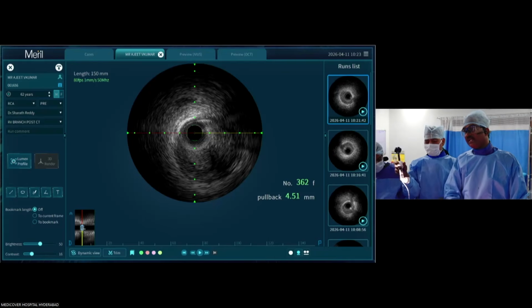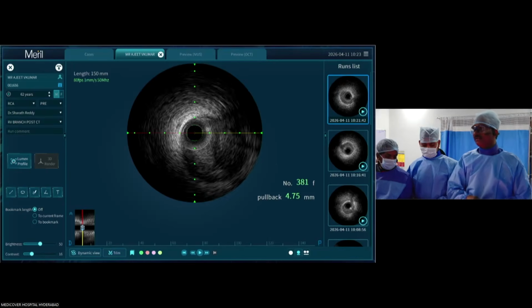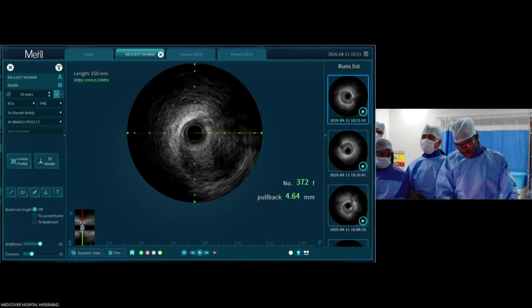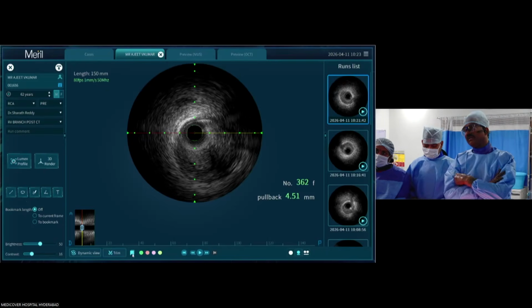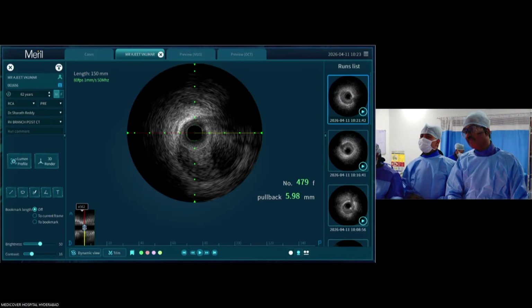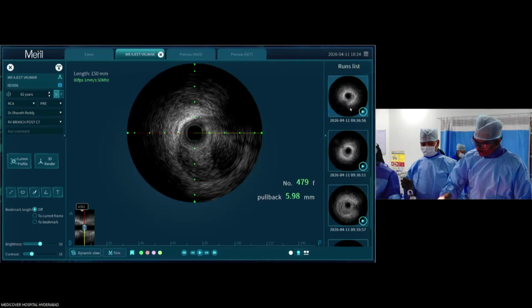Anyway, I'm just preparing the distal RCA now. We are just doing touch-up work, just to enlarge this negatively remodeled vessel. I'm not going to extend the stent; it will be only from block to block. Can you give us the stent size, please? I think that's enough. Anyway, we dilated with 3 cutting balloons here.